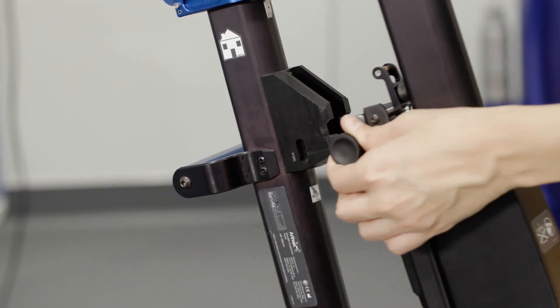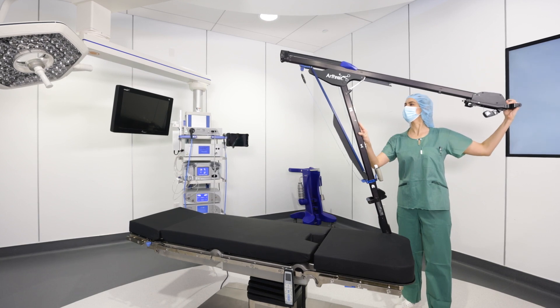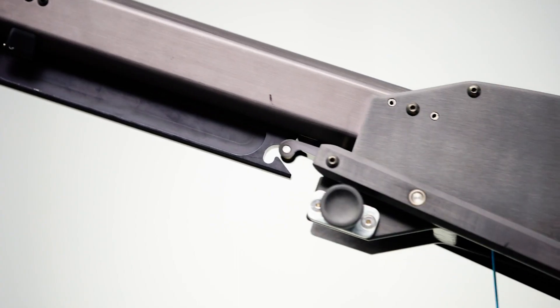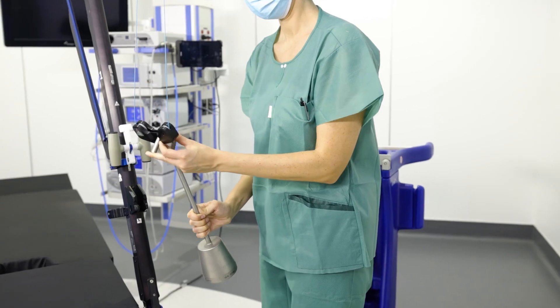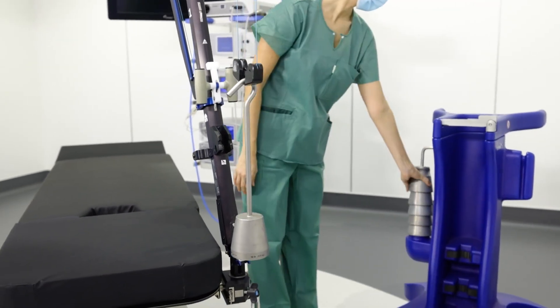Pull the safety knob out and raise the handle, unfolding the tower. Push the upper boom forward until the locking mechanism is engaged.